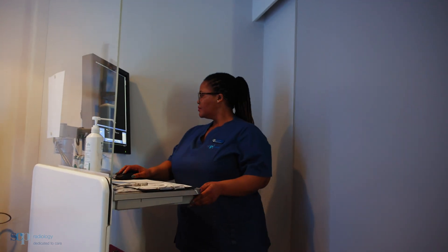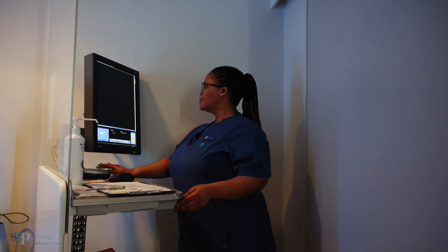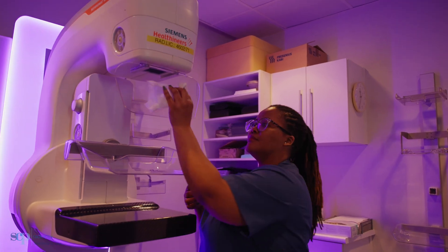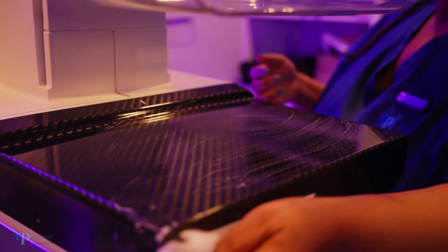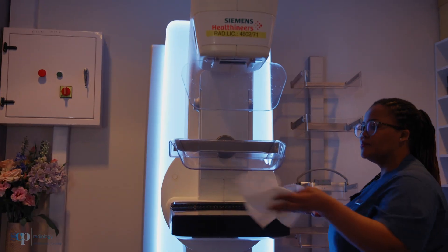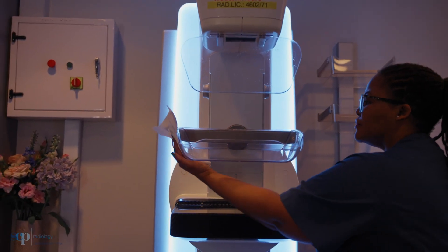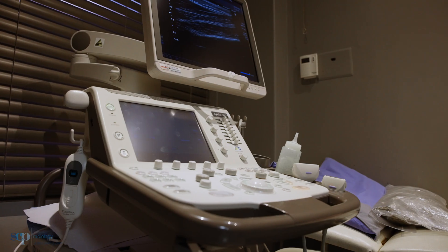The mammogram is always followed by an ultrasound if it's necessary — always if it's your first mammogram so that we can have a full examination, but not always for a follow-up. That will be dependent on the radiologist or if there are any findings on the mammogram.